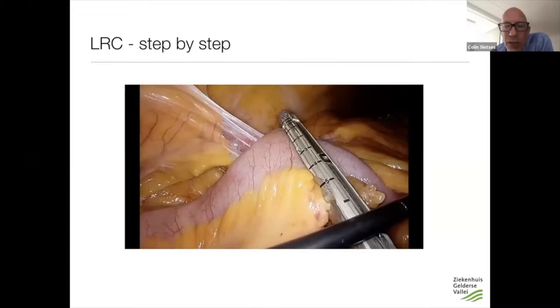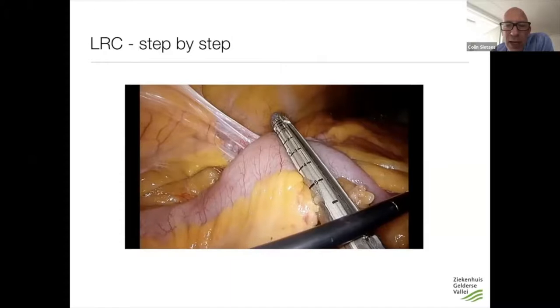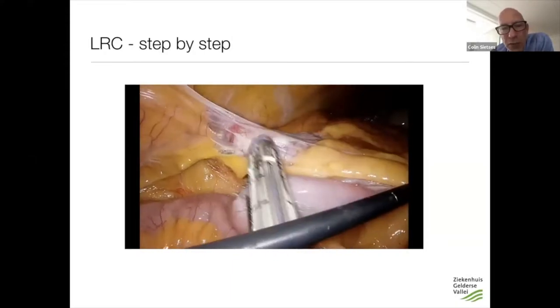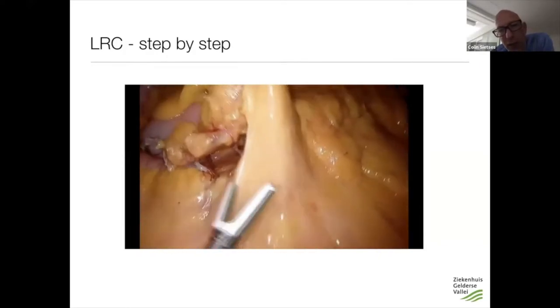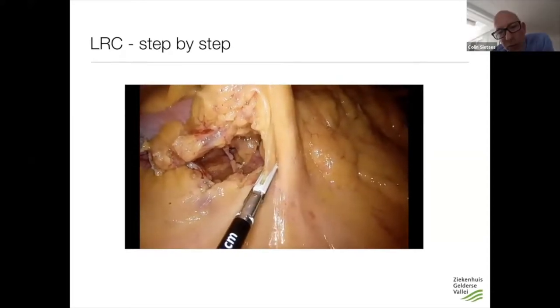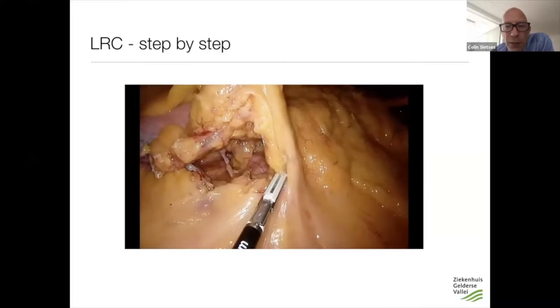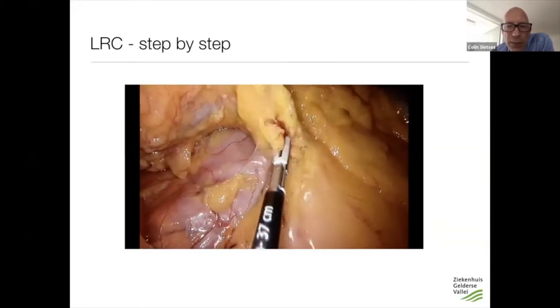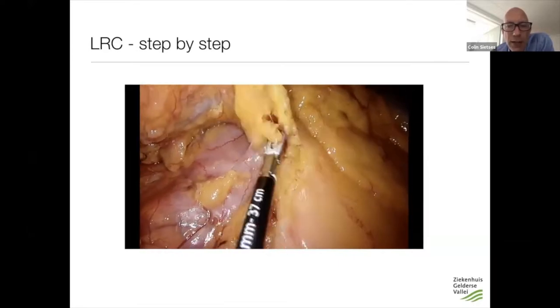The next step — and this is different from Walter and Andreas — I make a small opening in the mesentery of the small bowel, dissect the small bowel at the beginning, then lift up the mesentery and clearly see the vessels. I dissect these vessels all the way up to the duodenum, and by lifting them up you clearly see the vessels. At the head of the duodenum I start looking for the vessels and dissect them.